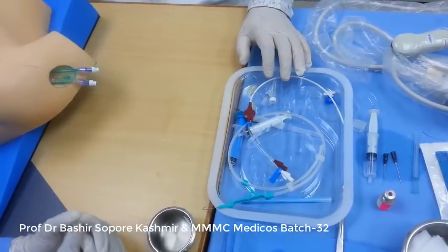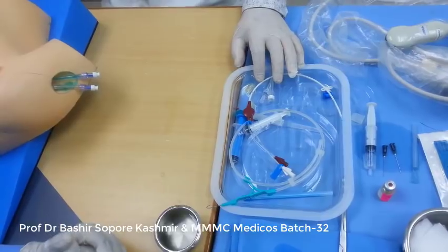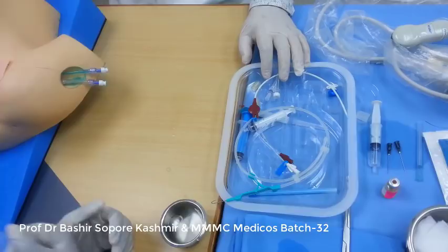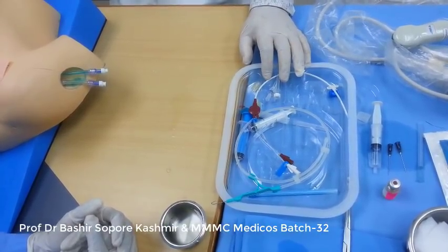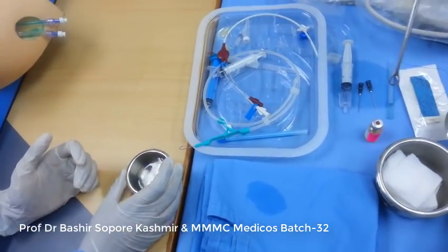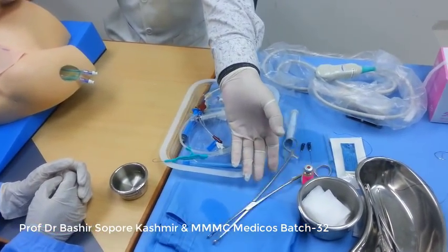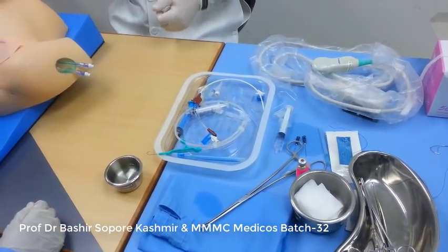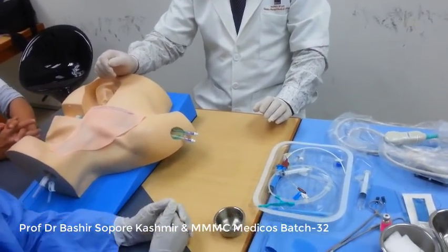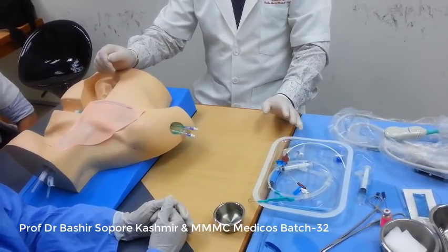Okay, so this kit also contains the chlorhexidine applicator, by which you can just clean the area. You understand? We call it the chlorhexidine applicator. Here we will be using the sponge holder and the gauze. The gauze will be soaked in the chlorhexidine, or in the betadine, and then we'll be cleaning the area. Did you understand my point? Yes. Okay, so I think we are talking about each and every item of this kit.